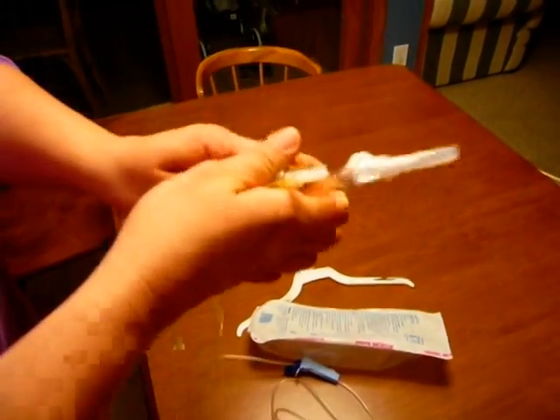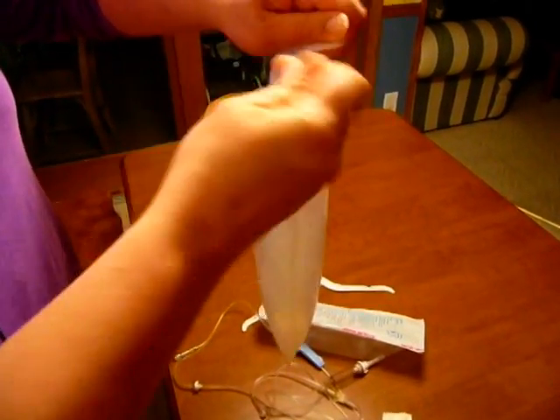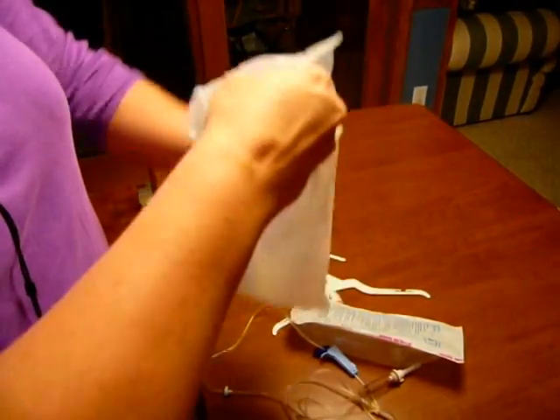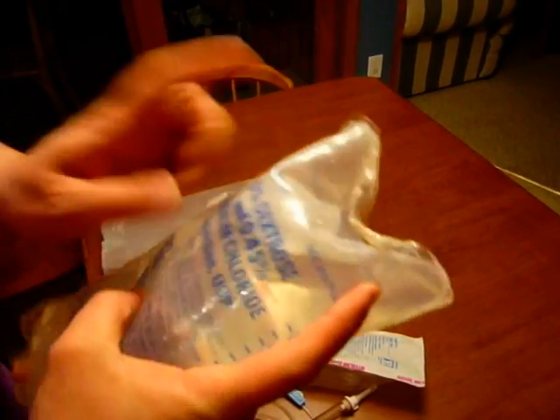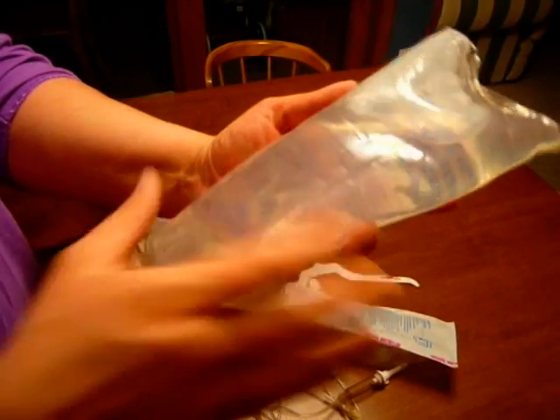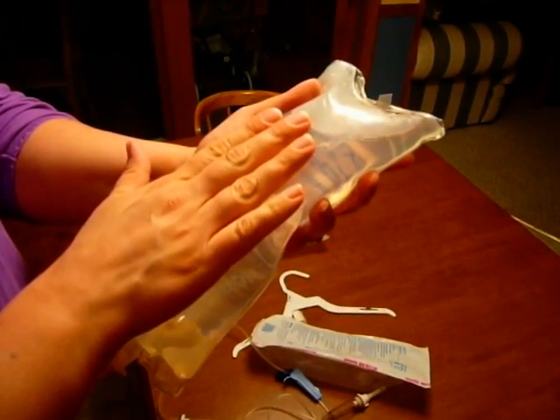I'm going to put both sterile connectors together and luer lock it down so it's locked in place. Now that I have the tubing ready, the next thing I need to do is open my bag. When you open your IV bag there's usually a rip tab and you rip it down the side to get it out. Once I take it out there's a few things I need to check for: the expiration date — this is December 2008 so it's fine — the correct solution, that the solution is clear with no precipitate, and that there's no leak, so I give it a little squeeze.